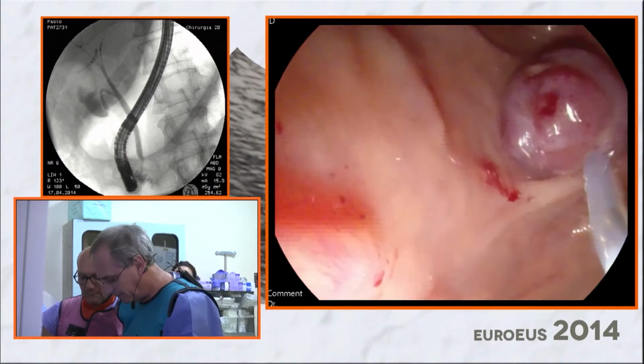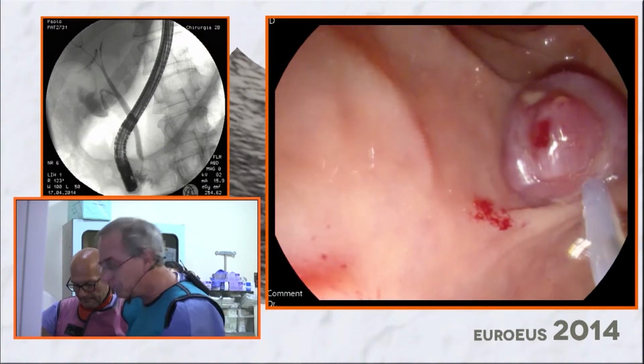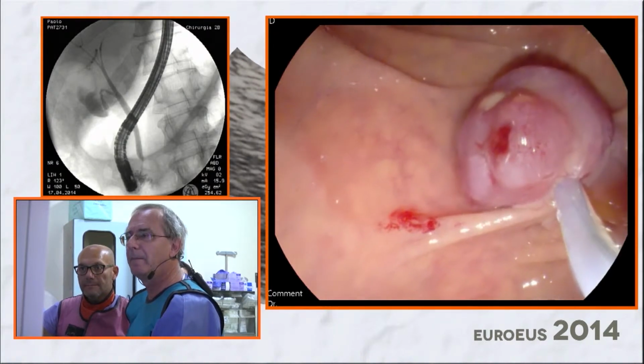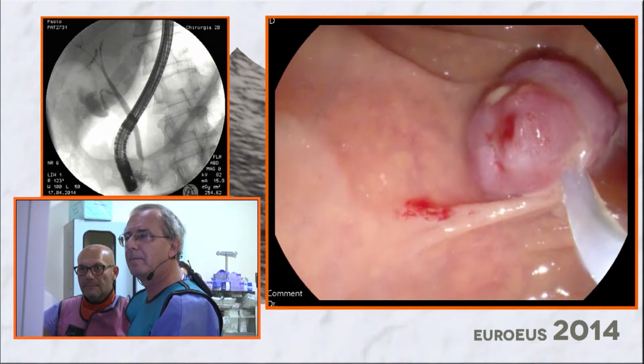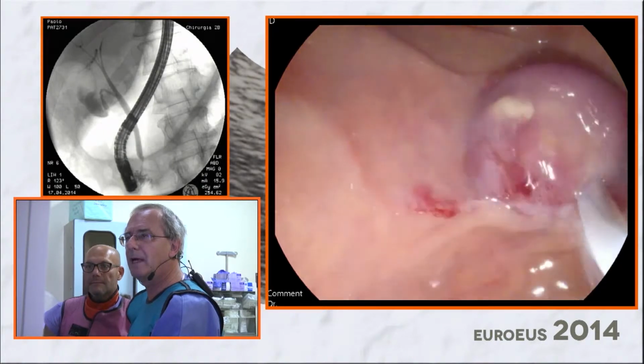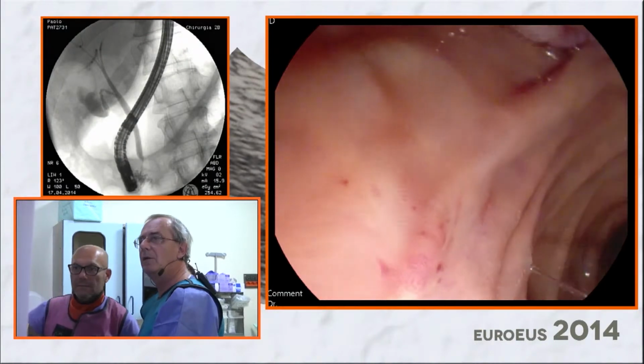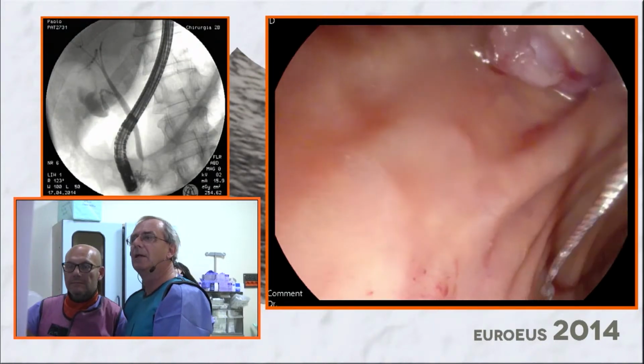Nothing happened. I don't know why, but nothing happens. Now, okay. Up, open. We try to collect the piece immediately.